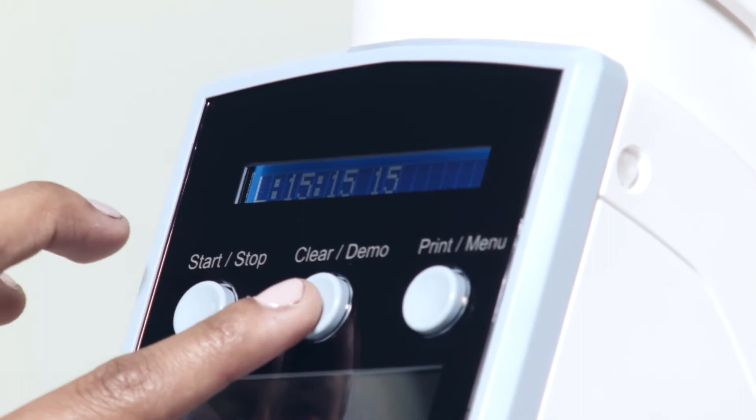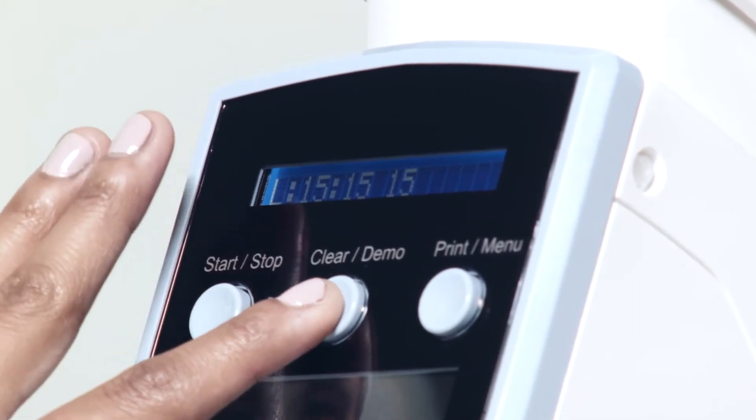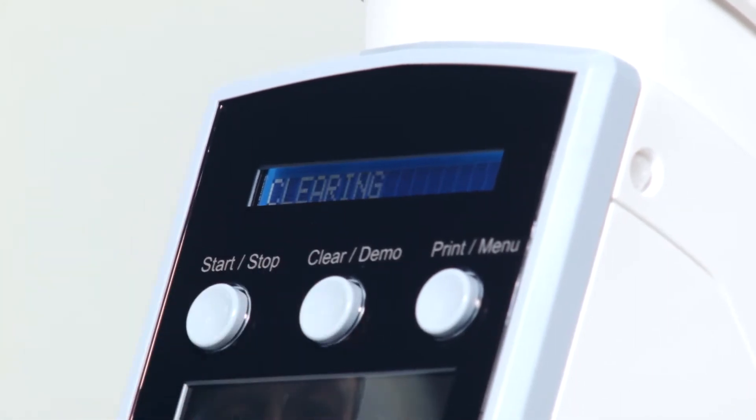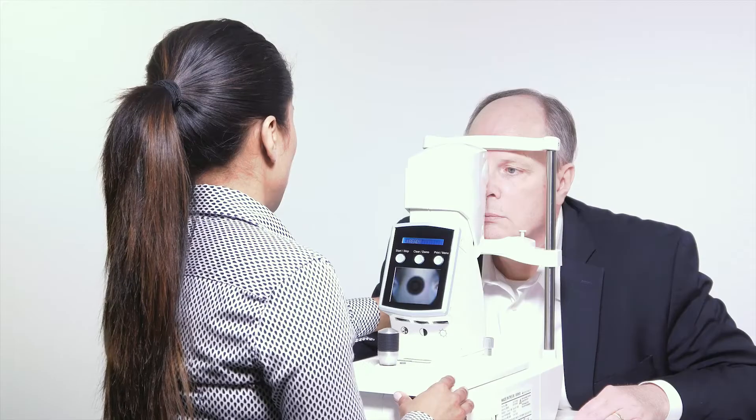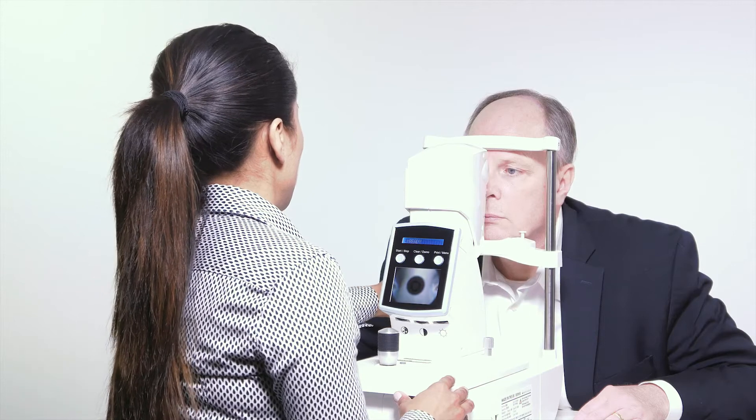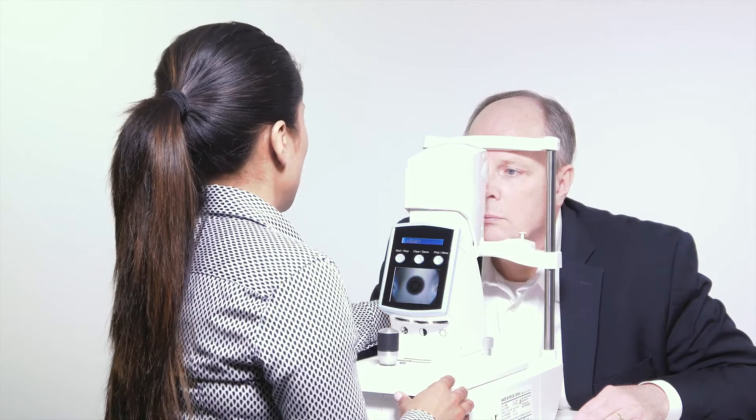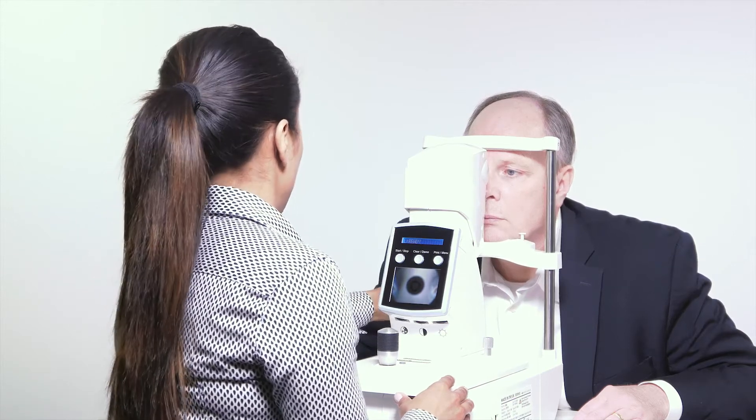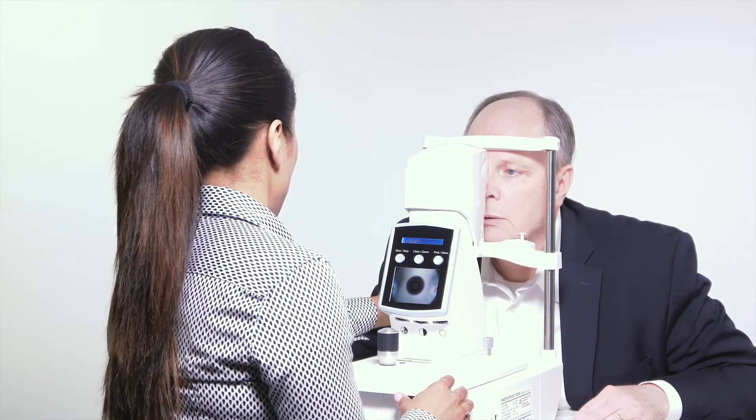Press clear demo to dispel any particles of dust or moisture. Ensure that the patient is comfortable and that they have removed contact lenses or spectacles.